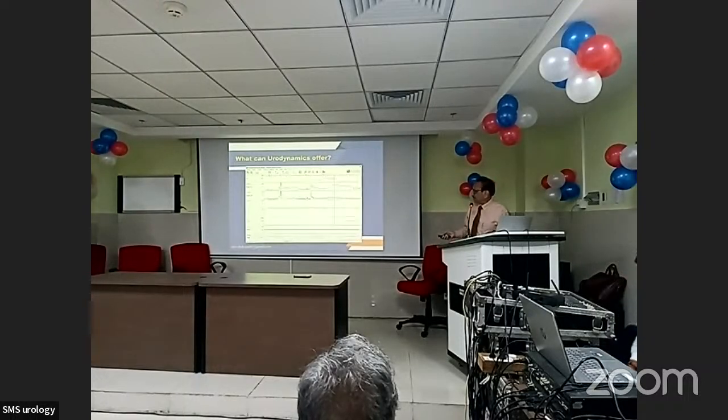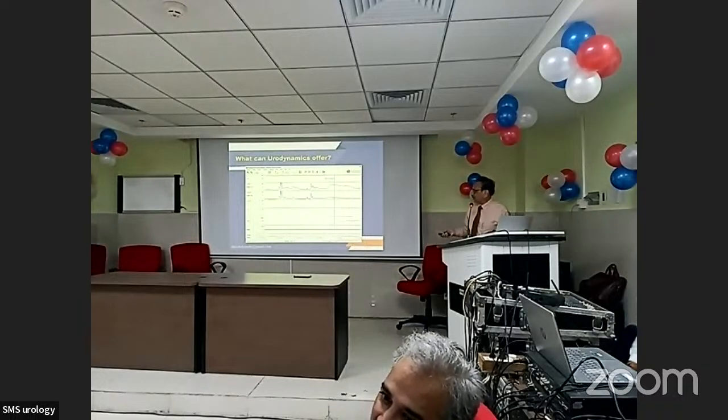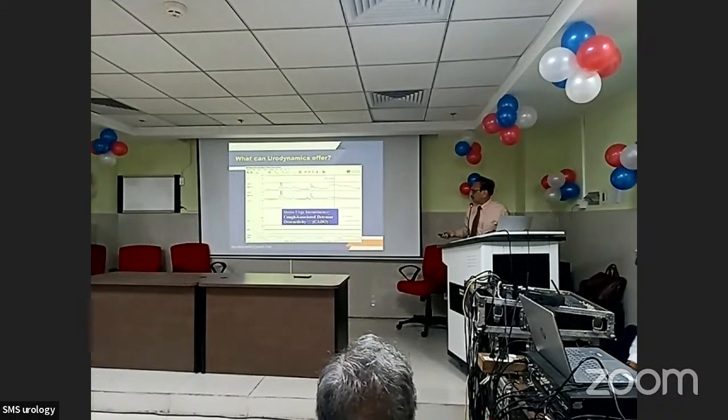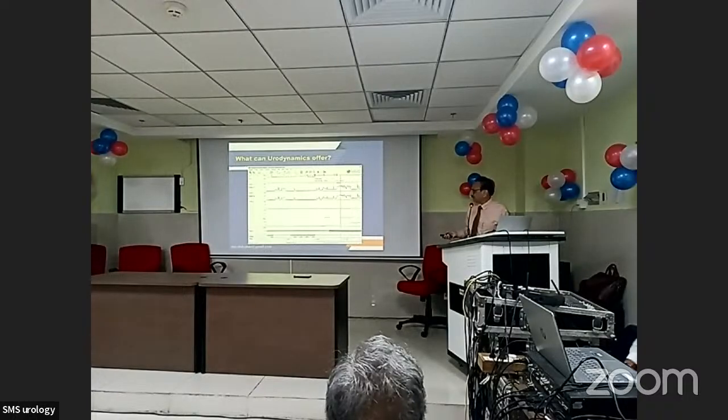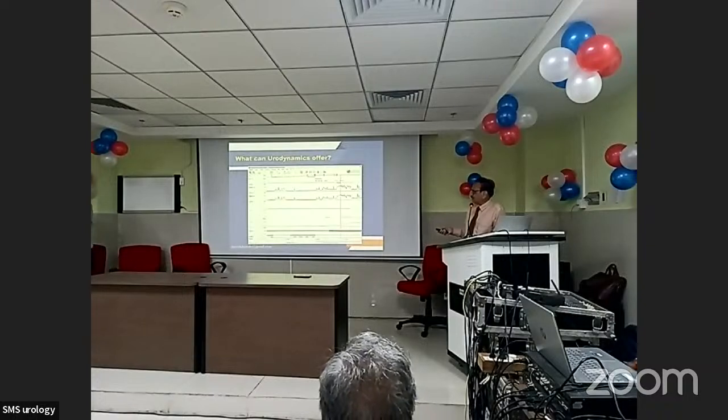So anyway, mixed incontinence, urge incontinence with detrusor overactivity. That's another feature we can make out easily. These are very common problems in elderly women. She has stress incontinence because she leaks on very low cough pulses, low in the sense 30, 40, 50. But at that low pressure she has a very severe incontinence, probably ISD.